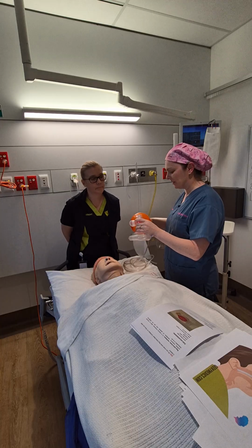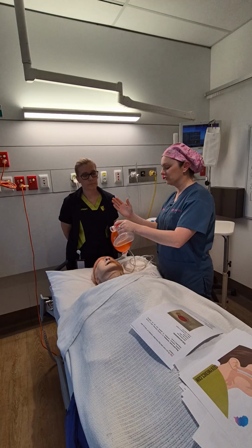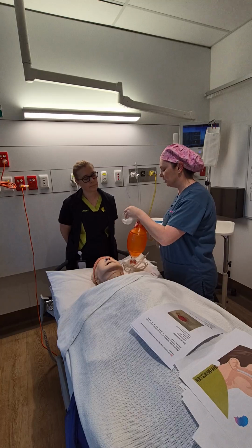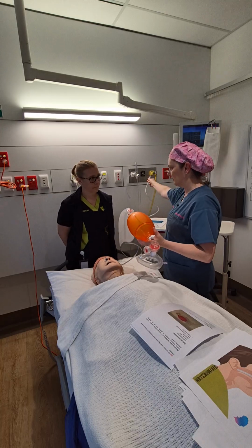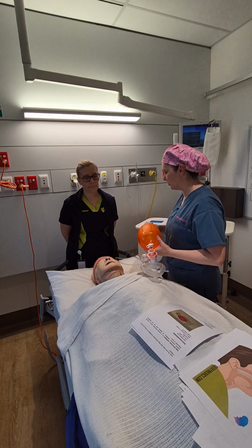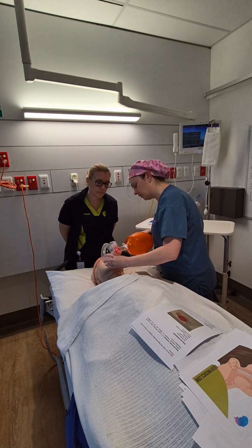Yep. So the key components are that we have a self-inflating bag. It's also got a one-way valve, so things can go in, but they can't come back out. We've got a nice padded soft mask, and a reservoir volume bag, and then this gets plugged into 15 litres of oxygen. Because if you're giving this, you're using it as a life-saving measure, and we want to get as much oxygen in as we can.